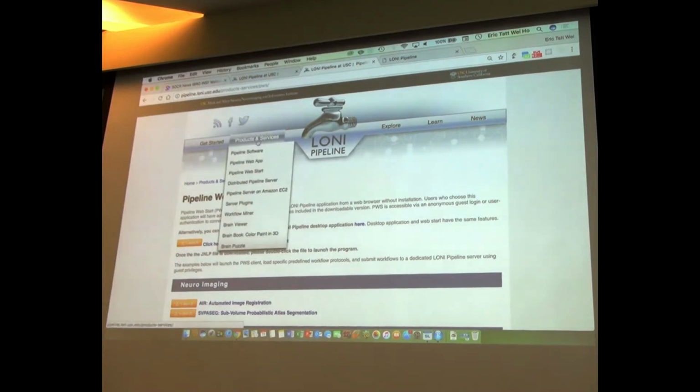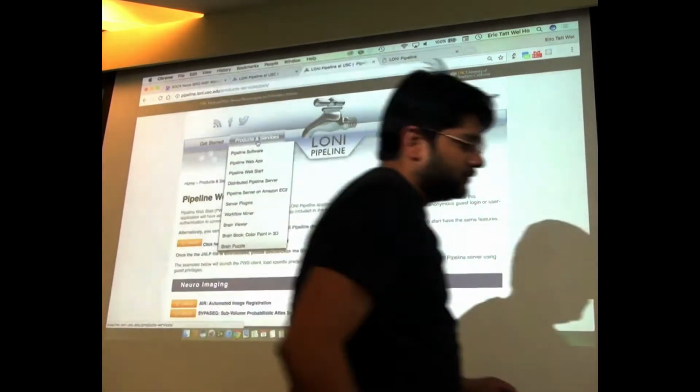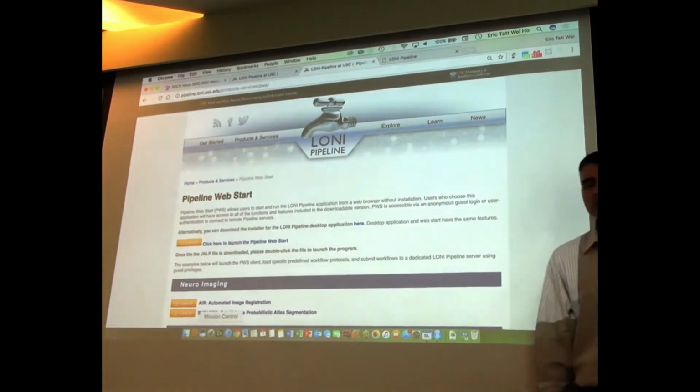So in that situation, so let's see, Eric? You can open it from the settings. I'm sorry, you can do what? You can open it from the settings. Maybe you can manipulate the settings. Do you want to help? Because I'm not exactly sure what's going on here. If not, we can install the client.